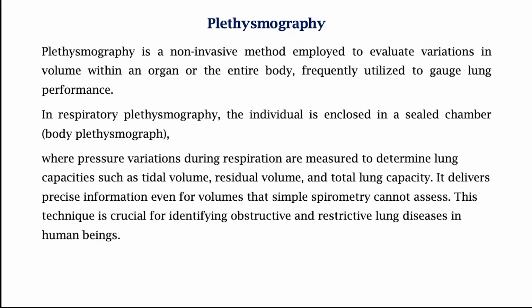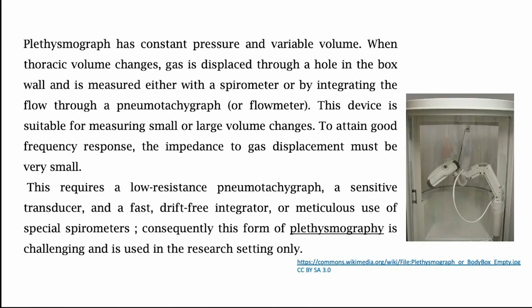No, but what is the critical challenge in this? The critical challenge is that you need to have that sealed container. An assumption that you're making is that the chamber has a constant pressure and a variable volume. When the thoracic volume changes, the gas is going to get displaced.